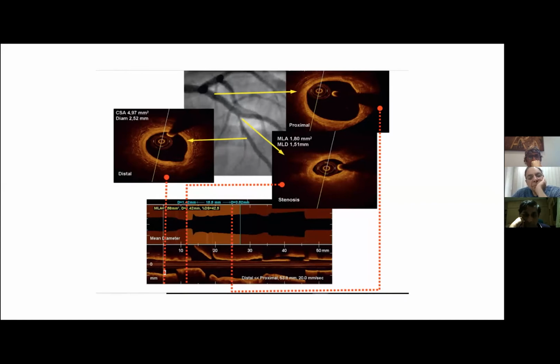So you have the tightest portion of the lesion here. You have a distal vessel, which is normal here. And the main vessel becomes normal only at this point, and you still cannot see the three layers. So from here up to this point, this vessel is abnormal. While you may think that you can get away with a small stent, these patients end up with restenosis later on.